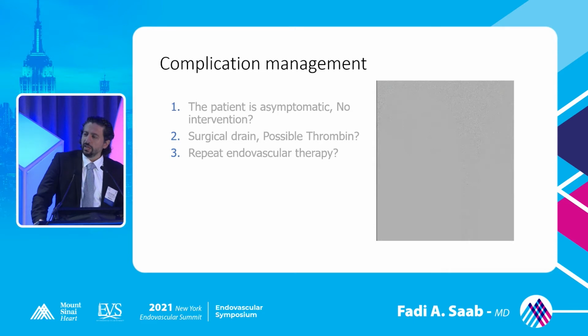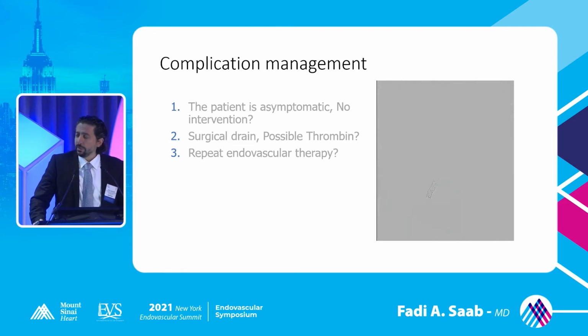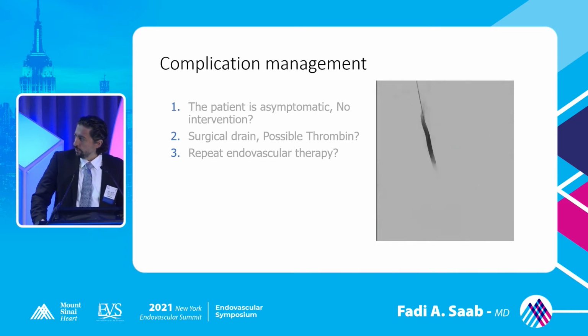Complication management. I had the pleasure of having this complication early on in my career. I cannot blame any fellows, but this is a patient that presented 30 days after an intervention we had on them, just with discomfort in the thigh. And my ultrasonographer was running down the hallway saying, we broke the artery, and we did.